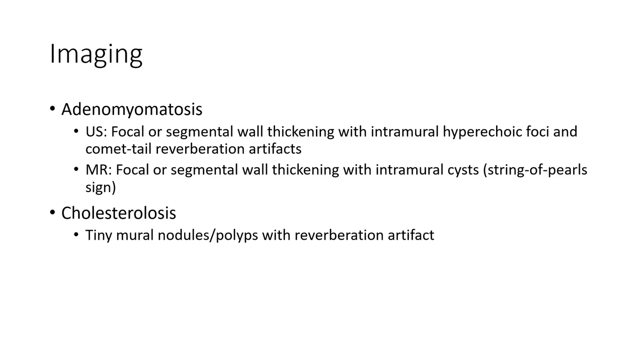Imaging. For adenomyomatosis, in ultrasound, we see focal or segmental thickening with intramural hyperechoic foci and comet-tail reverberation artifact. So the focal and or segmental thickening with intramural sinuses, string of pearls sign.